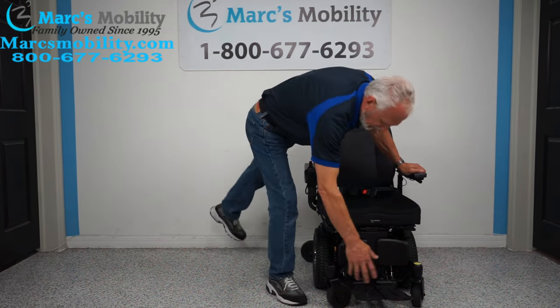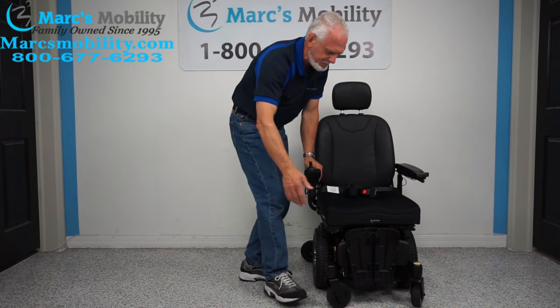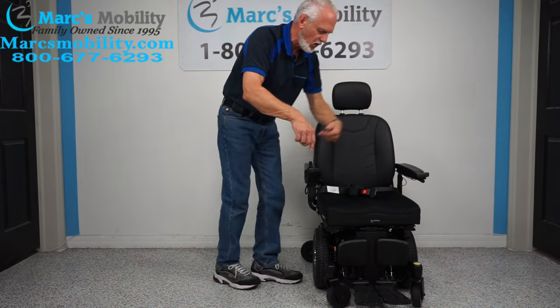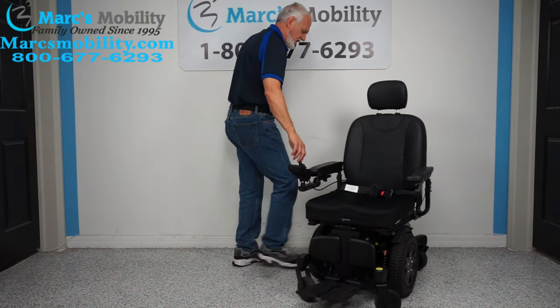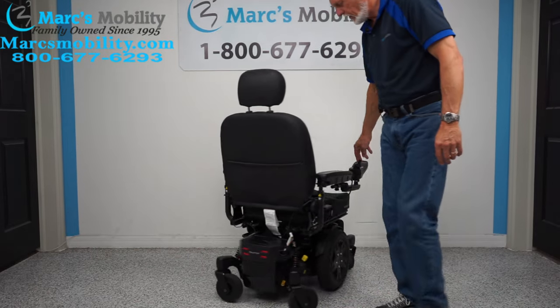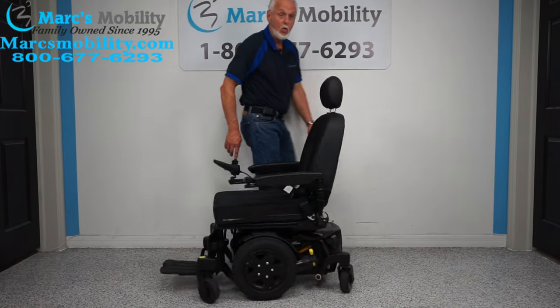It's got gel in the back and foam in the front, and it's contoured — you can see how my hands are contoured. These foot plates do not move, but you can flip them up when you exit. This chair has a really good turning radius — it turns on its own length. You can see how quiet it is.